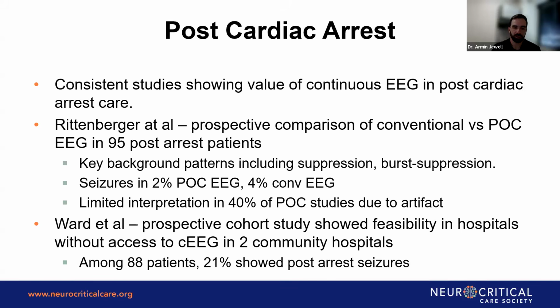The part that became an issue with the point of care studies was mainly artifact related. As you may imagine, in the ICU there are a lot of different electrical tools and things that can limit some interpretation. And so in some of these studies, there is even a limited interpretation because of the artifact. We're going to get into some of the limitations of point of care EEG also, and that's one of them: the artifact. Specifically in the ICU, it did have quite a bit of artifact that potentially led to limited interpretation versus conventional EEG.